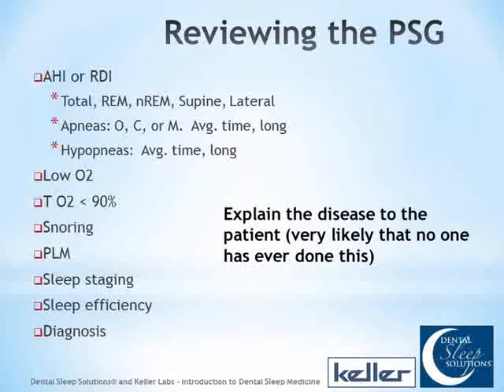We look at the sleep staging, which is one of the big advantages to a PSG over home sleep testing, and look and see how much delta sleep they got. Look and see how much REM sleep they had, and their sleep efficiency. Did they actually sleep during the test?